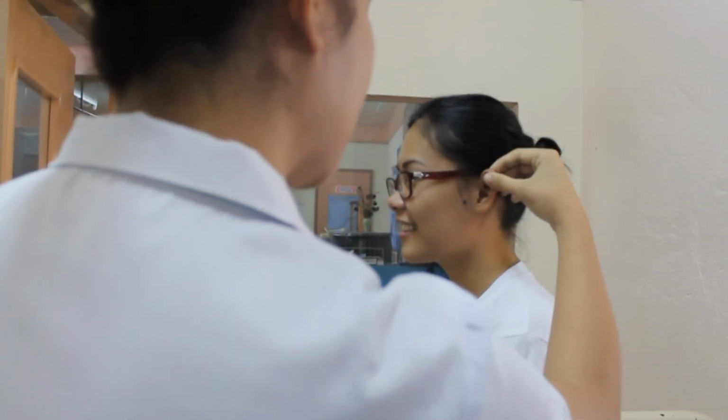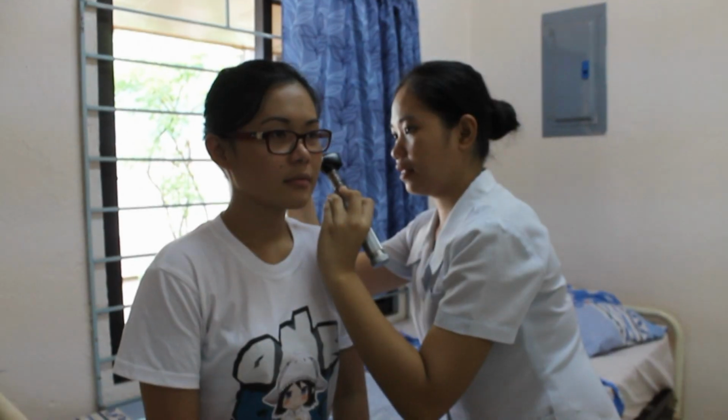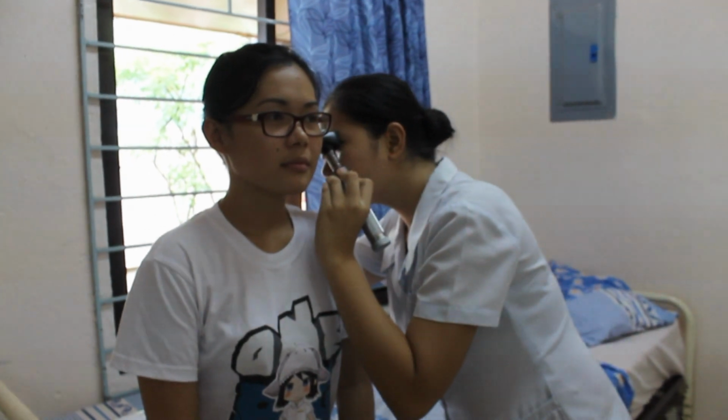For the otoscopic examination, this is the otoscope. The otoscope allows you to directly observe the ear's internal structures. Ask the patient to sit with his back straight and head tilted away from you. Straighten the ear canal by grasping the auricle and pulling it up and back.